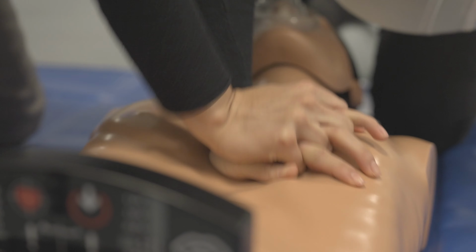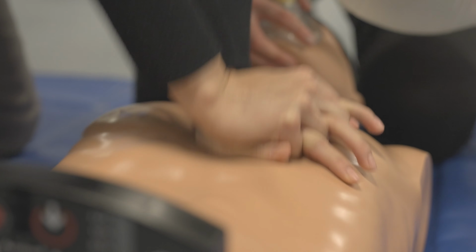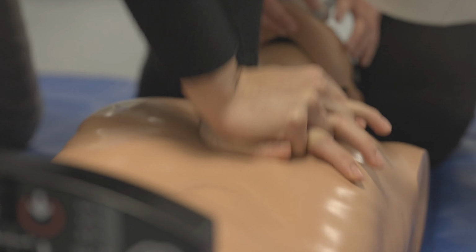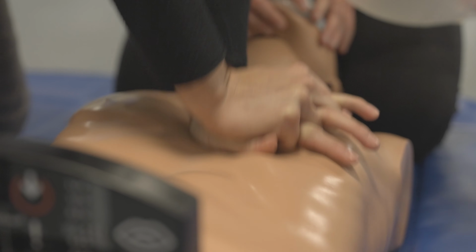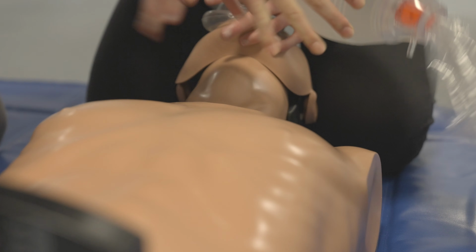Once the shock has been delivered, resume chest compressions. The AED will have an internal timer to check again after 2 minutes and will announce when to stop compressions. Not all cardiac arrest victims will have a rhythm that can be shocked. If the AED indicates that no shock is advised, just continue with chest compressions until help arrives.